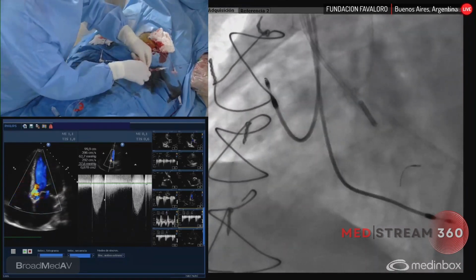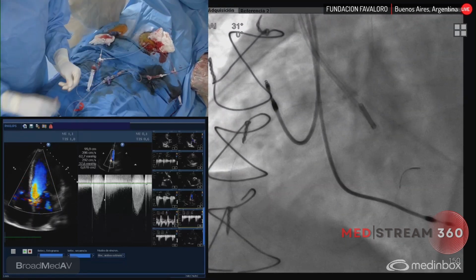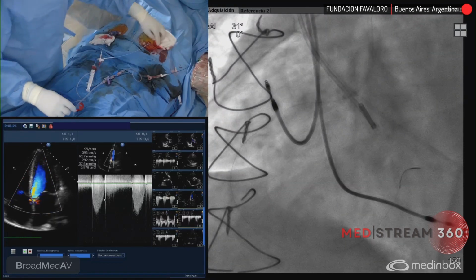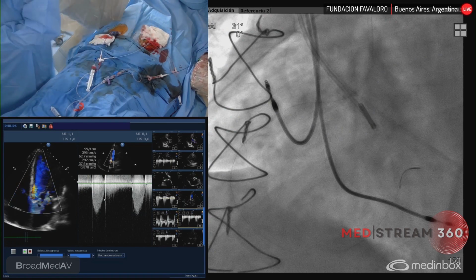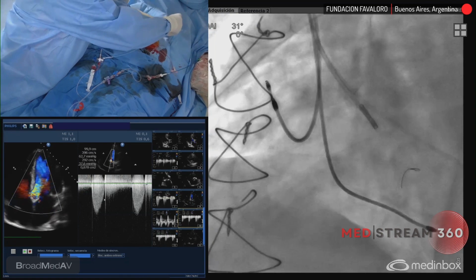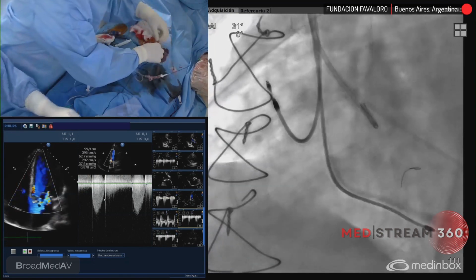Give me the 3.5 by 18. While this 10 is there, I'm going to advance. We haven't prepared for rapid pacing. We are going to do it with the wire. I have to put the big needle here on the skin. More things than usual for a TAVI case.